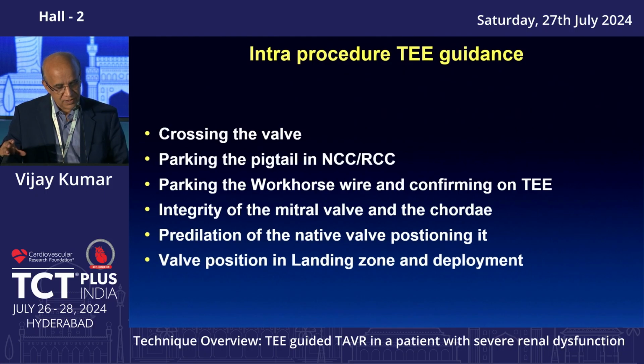And then these are some of the other things that your transesophageal echo will help with, especially if you have taken these high risk severe renal dysfunction patients under general anesthesia. At every step, whether you are parking the wire or the pigtail in the LV cavity, sometimes you can get entangled in the subvalvular mitral apparatus.